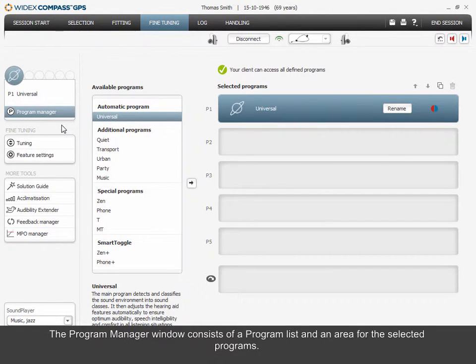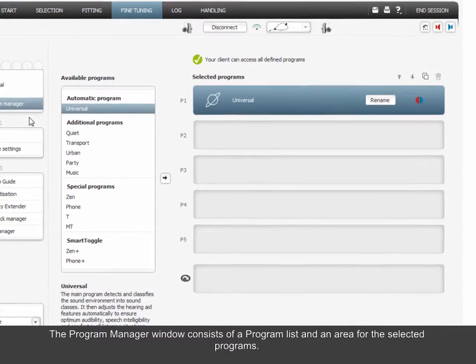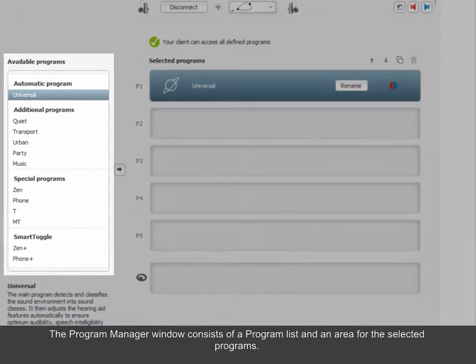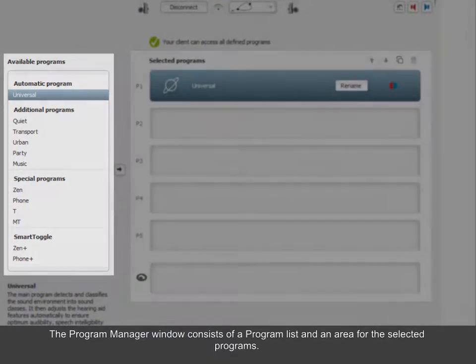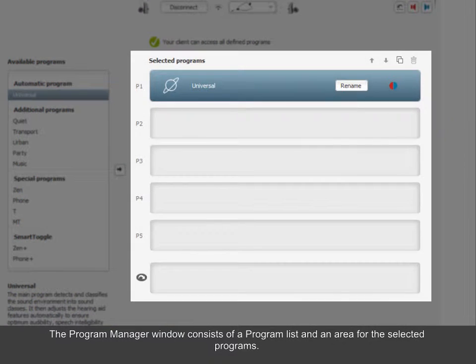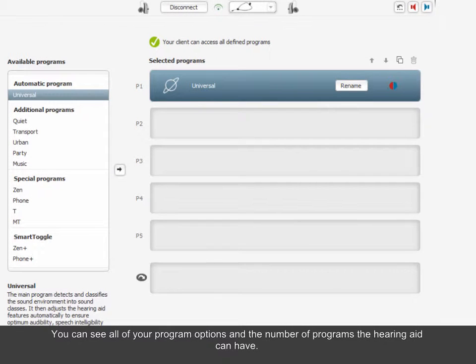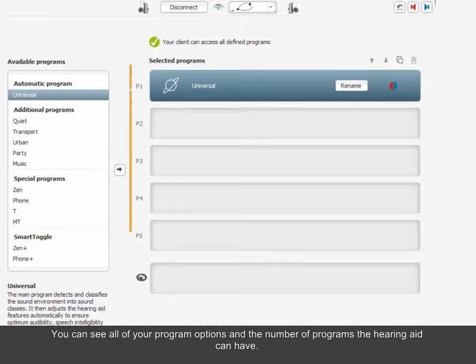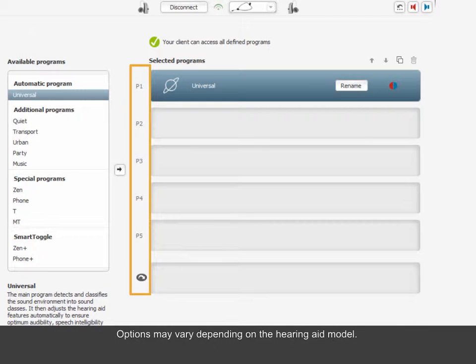The Program Manager window consists of a program list and an area for the selected programs. You can see all of your program options and the number of programs the hearing aid can have. Options may vary depending on the hearing aid model.